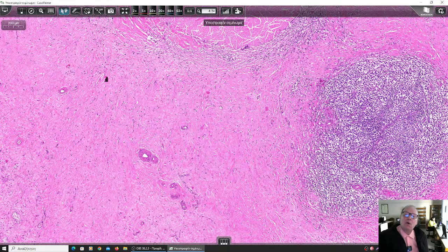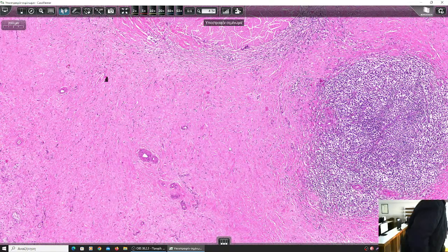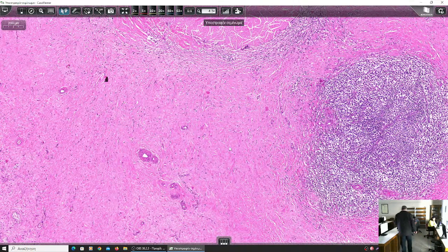to understand what is all this tissue, the scar tissue, that has replaced a large amount of seminomatous cells. This is called regression. What is regression? It is a process that either the whole amount of the tumor or a part of it, in this case a large part of the tumor, is replaced by fibrous tissue. The same happens in melanoma sometimes of the skin. So what's the significance if we have this partial regression?